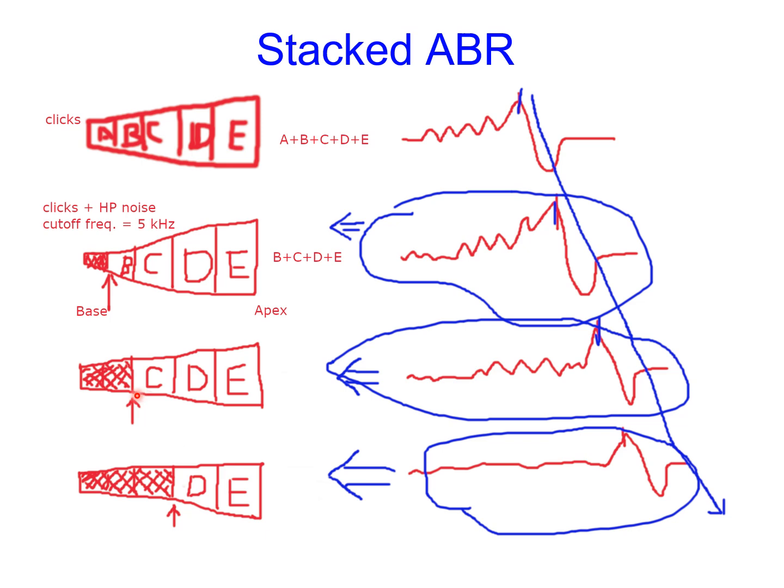As we move toward the apical end, the basilar membrane is even wider, softer, and floppier. As a result, the ABR latency will be even more prolonged. As we continue to change the cutoff frequency toward the apical end, the wave 5 latency will become longer and longer.